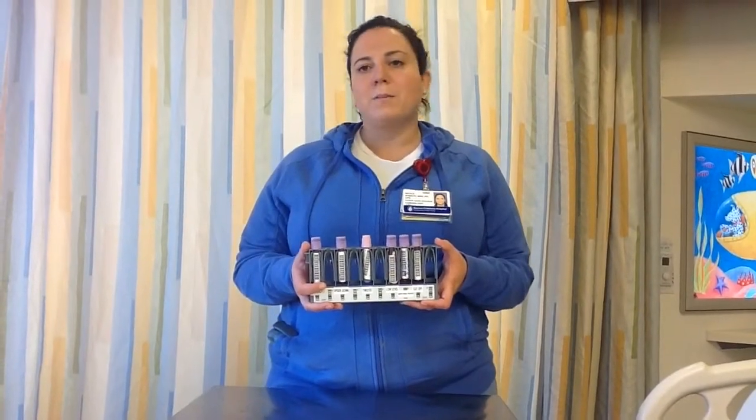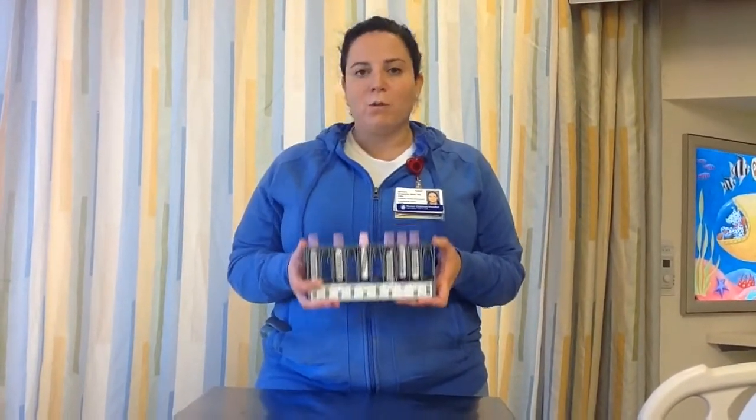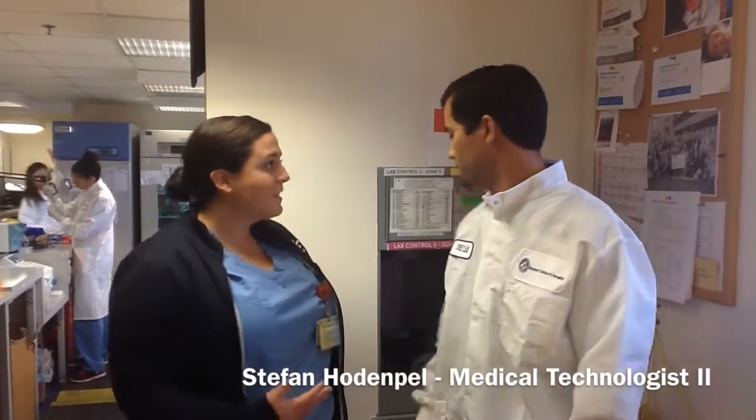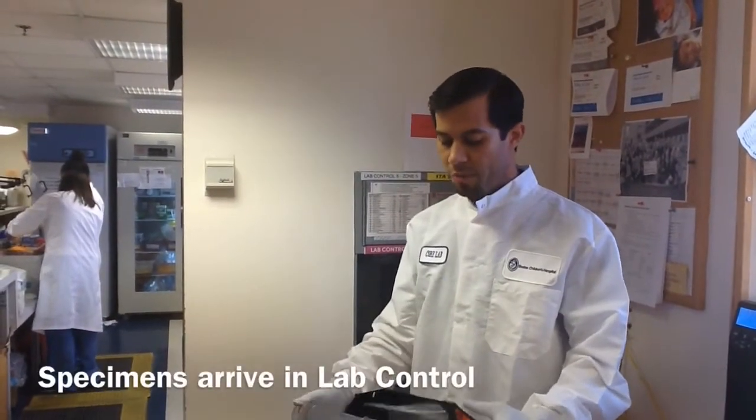Ever wonder what happens to your lab specimens when they leave your floor? Let's go talk to our friends in the lab to find out more. Now we're up in lab, and the first stop for your specimens is lab control. Stefan's here to tell you a little bit about what happens. When the specimens are sent from the floor, we receive the tube in lab control, open the tube, and take out the specimen bag.